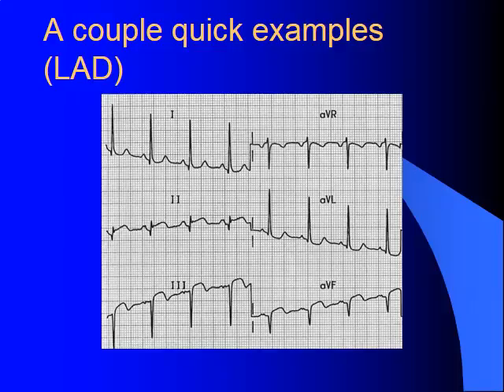We notice that it has a more positive deflection. So we look at our chart with the arrow up, meaning a more positive deflection, and we can say that our axis is negative 30 degrees, which is within 5 to 10 degrees of the exact QRS axis. You can consult your chart and know that is a physiological axis deviation.